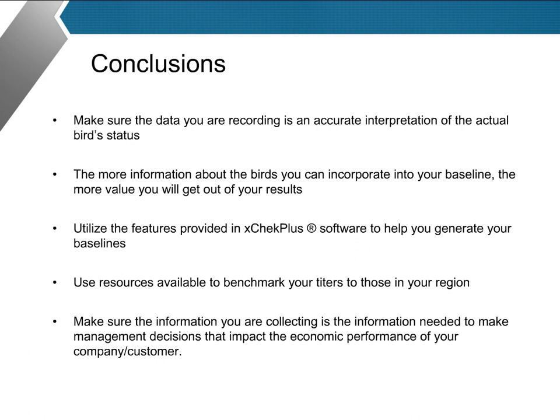Use the features provided in XCheck Plus to help generate your baselines, and then use resources available in your area, such as reaching out to others in the industry, going to regional meetings, etc., to benchmark your titers against others in your region. Make sure the information you're collecting is information that will be used to make management decisions, and that economic impact will be there for your company or your customer, adding value to the testing.